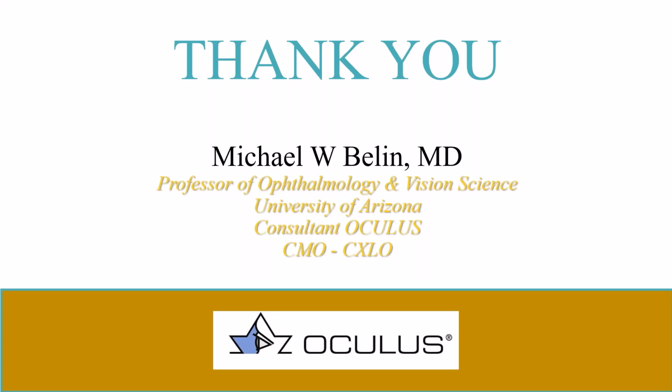I don't have a problem if people look at it. Many years ago, I won't mention who, there was a speaker at a conference who basically said IHD is 100% accurate, and I just went in and showed him a bunch of maps where the IHD was abnormal and the BAD was completely normal. It's a good parameter. I think you can look at it, and if it's abnormal, it is at least suspicious, but it's not necessarily specific. It is sensitive, but not specific. Correct. Excellent.